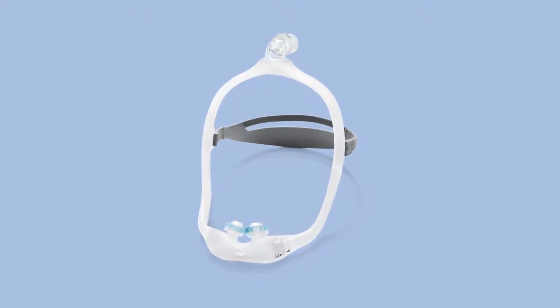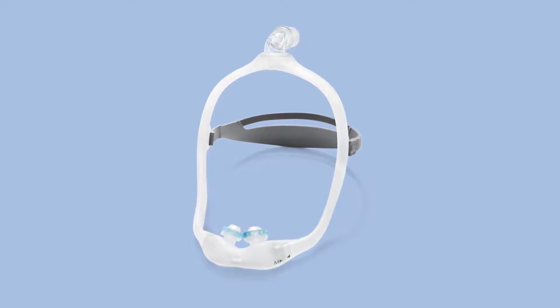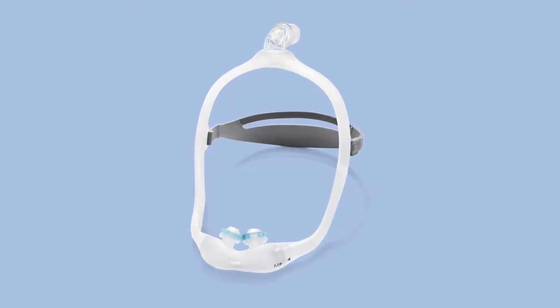Cleaning the Dreamwear gel pillow's frame, cushion, elbow, tubing quick release, and headgear before the first use is very important.